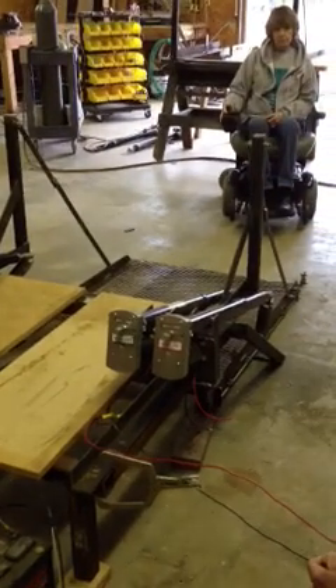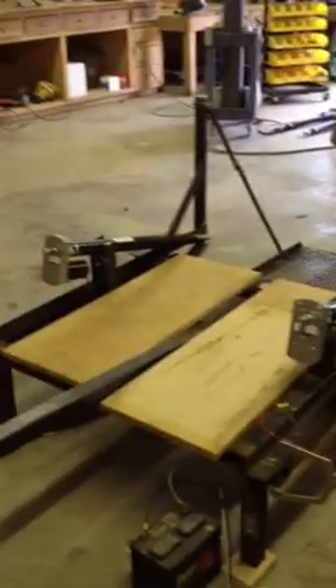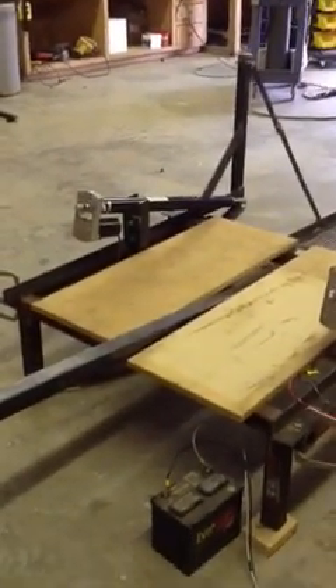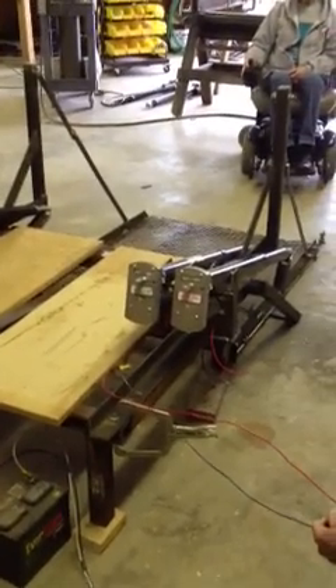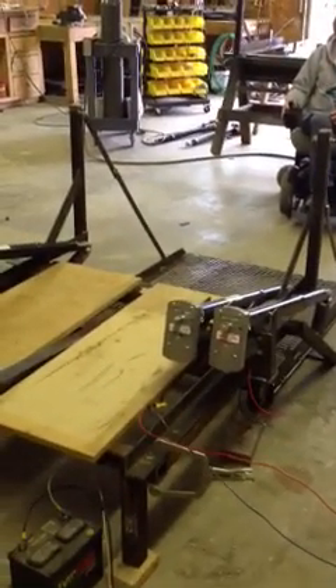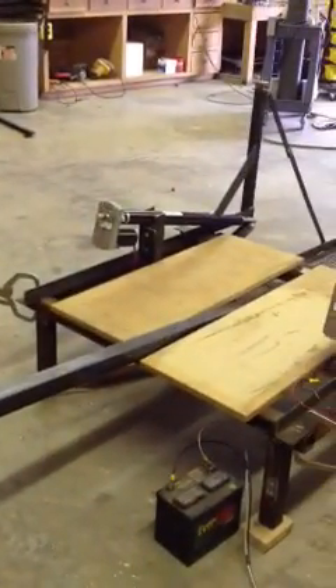This is our lift for golf carts. This is our prototype. We've got it set on a frame just to get the height, set 12 inches off the floor. Of course, it can be made lower or higher depending on customer preference.